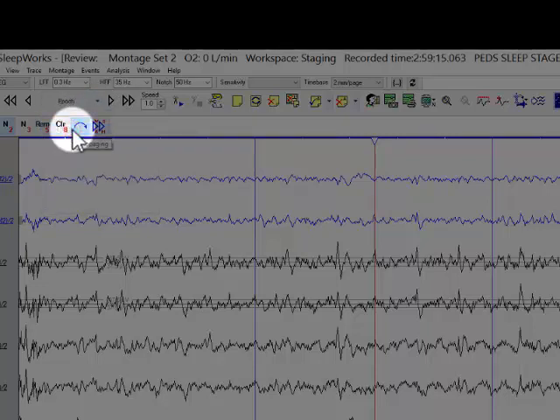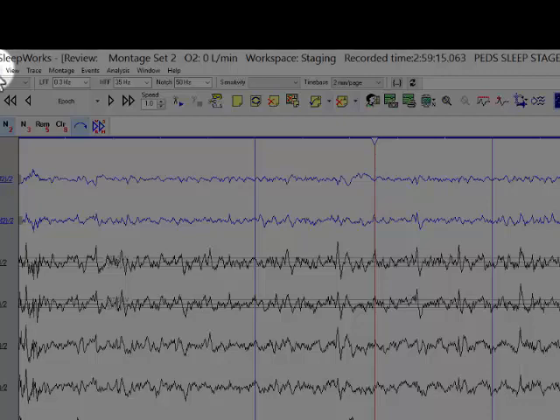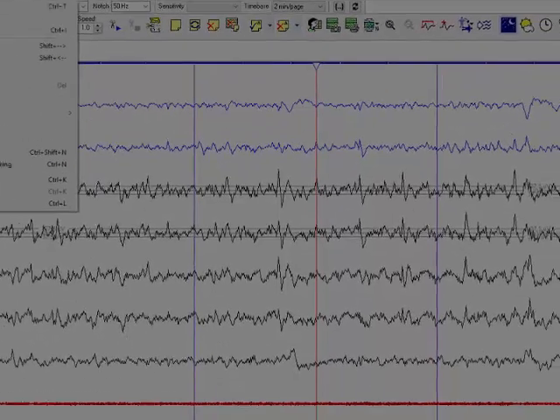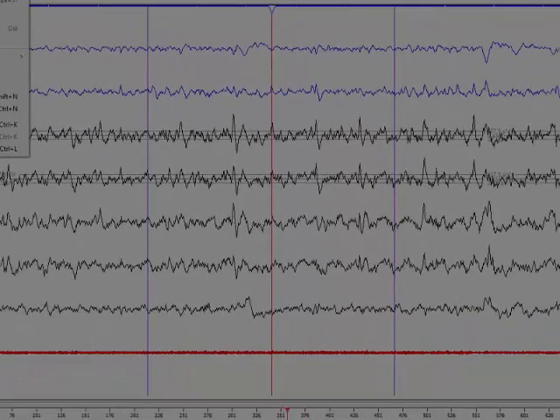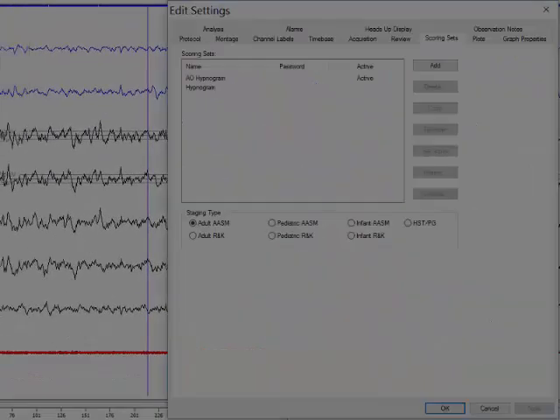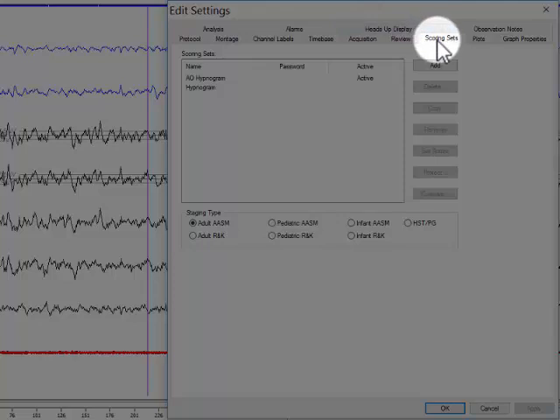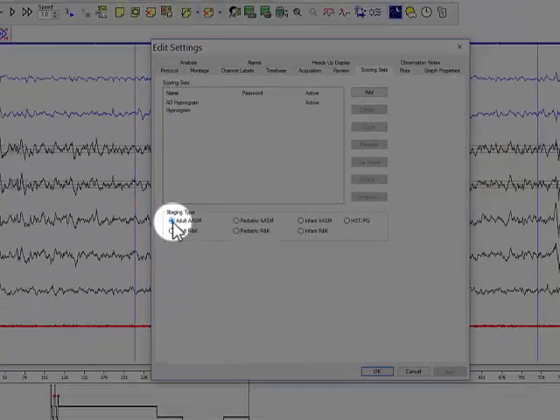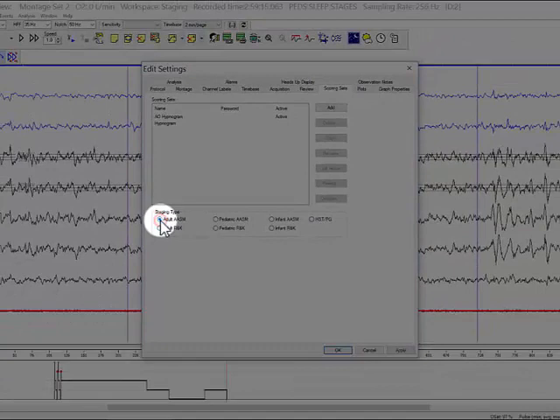Then, make sure that you select the appropriate staging terminology. Go to Edit, select Settings, select Tab Scoring Sets, and select the staging type, for instance, the adult AASM. Then click OK.